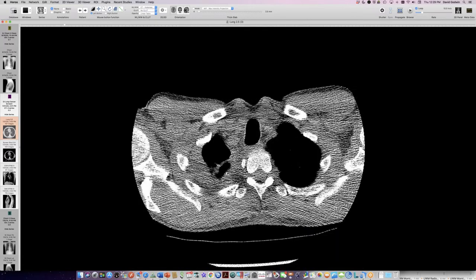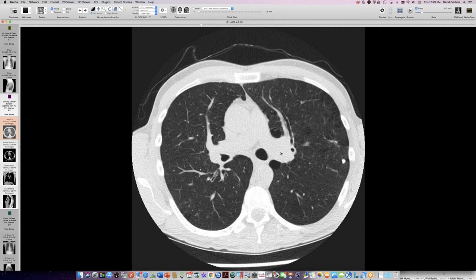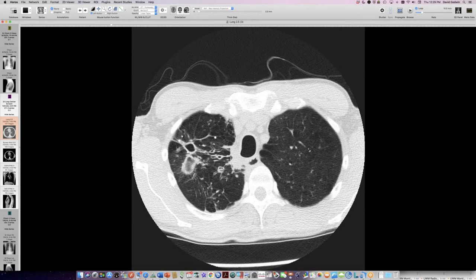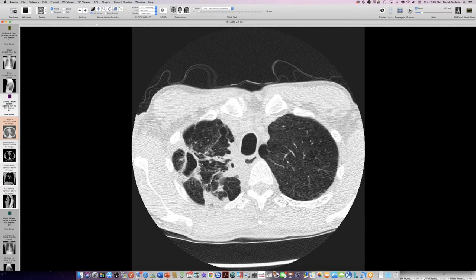It could still be histo without anything in the spleen, that does happen. And this is an infection here. Notice the emphysema, the bullae along the edges, but centrilobular emphysema as well, continues to smoke. And this is MAC, so mycobacterial infection. Person is managed on chronic antibiotics and the stuff waxes and wanes. But this is one of the patterns that Jeff has described before, an older man, a smoker in this case.